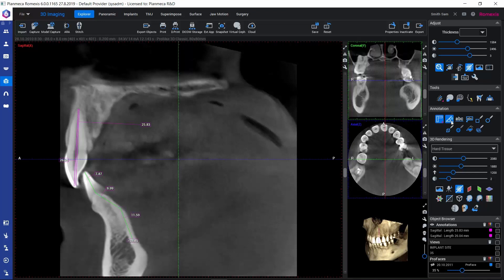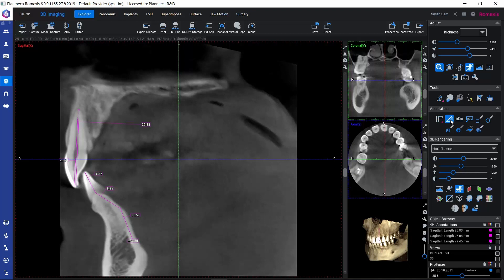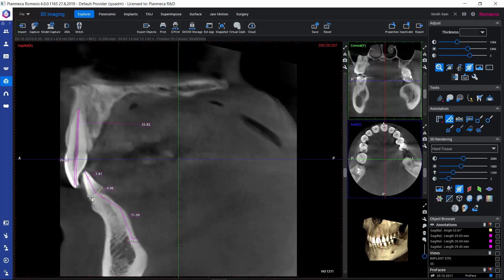We also have an angle measurement tool. To use it, we first draw a line and then click in order to define the angle that we would like to measure.